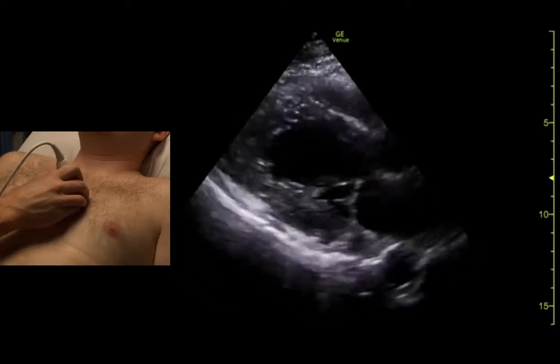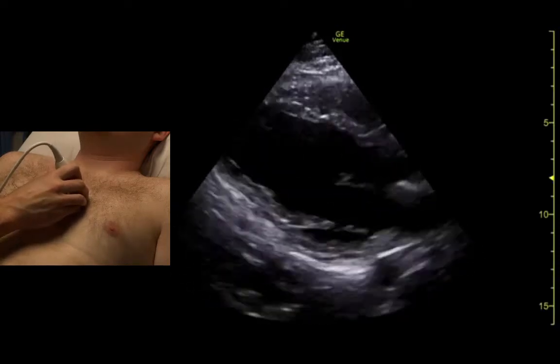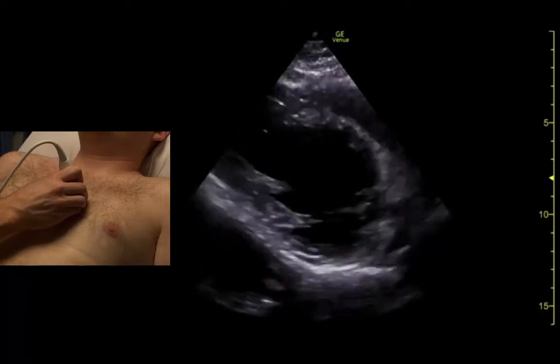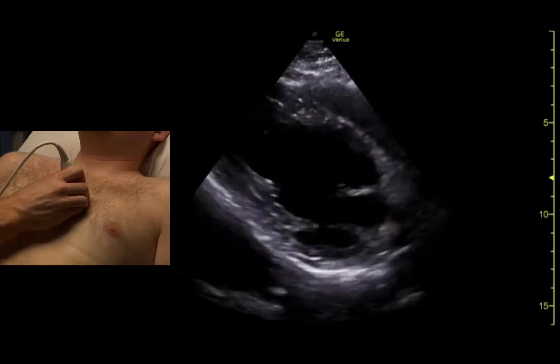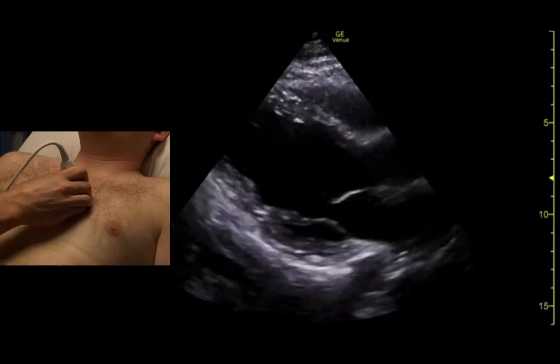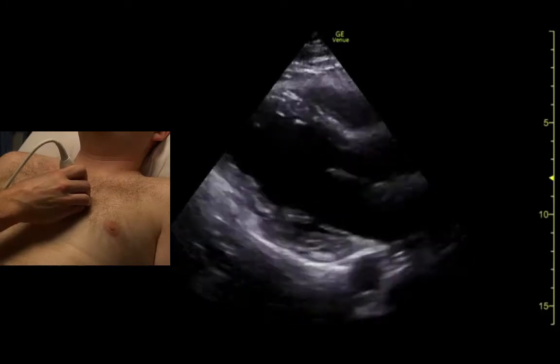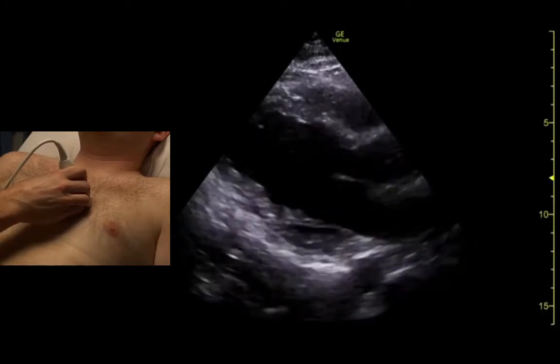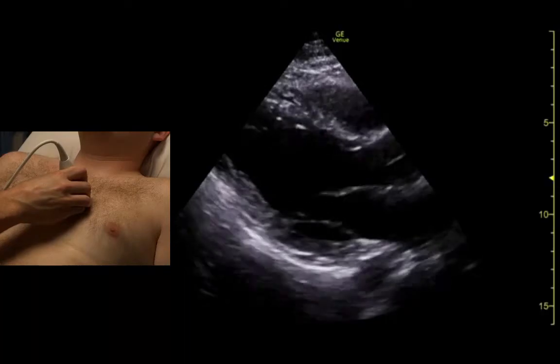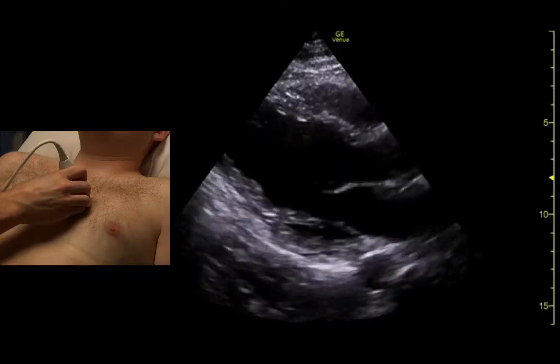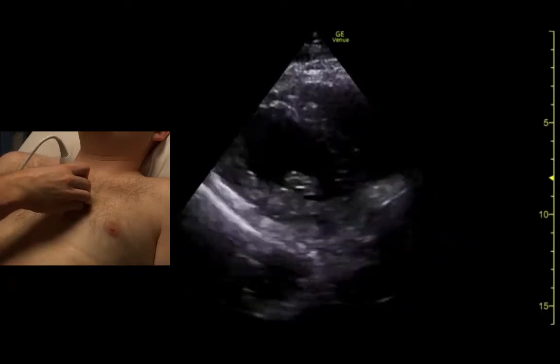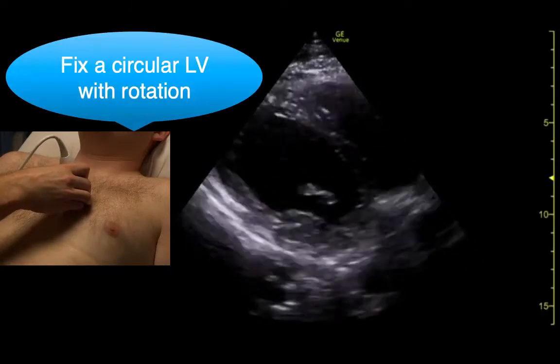A couple of mistakes people make sometimes is they're rotated too much, so the ventricle looks kind of like an egg or a partial circle. You want to see as much length as you can, and you want to see the full diameter of the aortic root and the mitral valve if you can. So if it looks kind of circular, it's off — try to fix it.